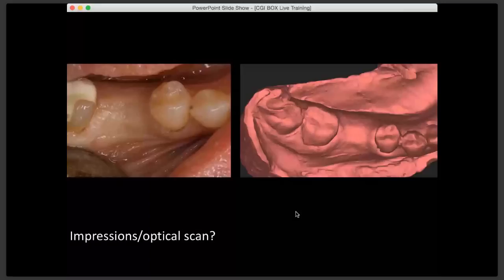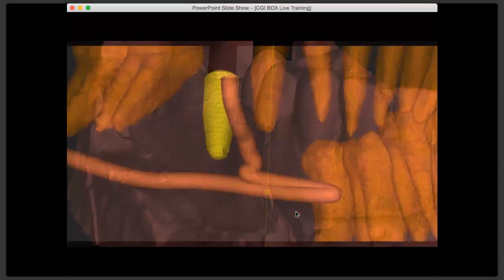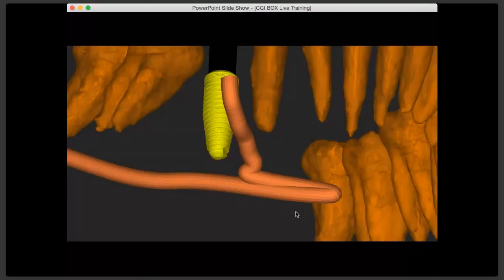Then you take the data, submit it to the company. It can be service or send them a CD. Better to go through the cloud. It's greener, easier, less parts and pieces involved, less risk of inaccuracies, and submit models or an optical scan STL. I hope that by now you understand how the STL works. Now, you did the data, the company made the merge for you. If you use Blue Sky Bio, you do the merge yourself.